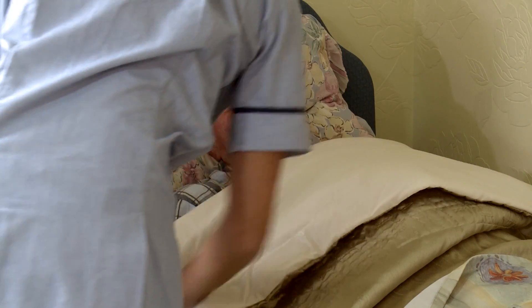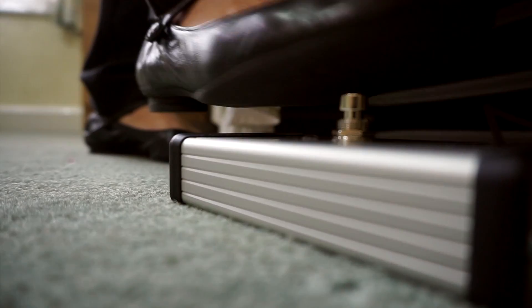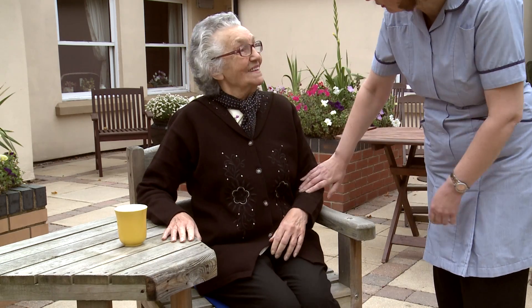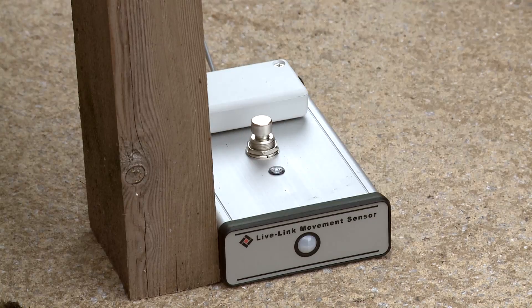The batteries will last you for two years on the basis of ten activations a day. It's multi-purpose use — you can have it as a movement sensor at night. During the day you can link in a chair pad, so if a resident gets out of a chair it'll tell the staff that somebody's up and about.